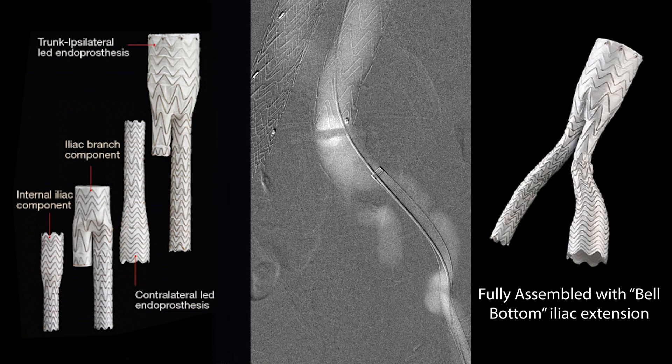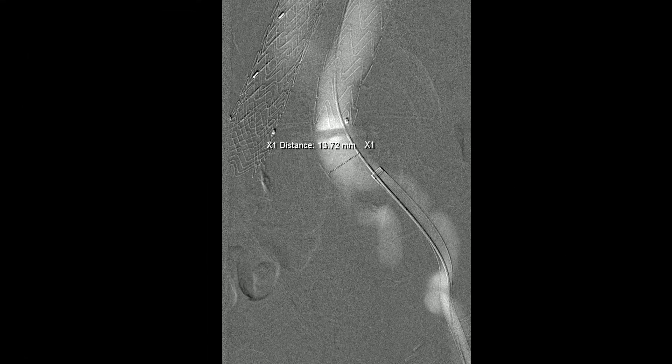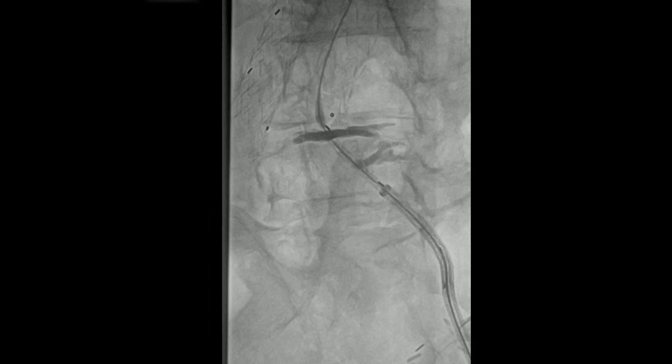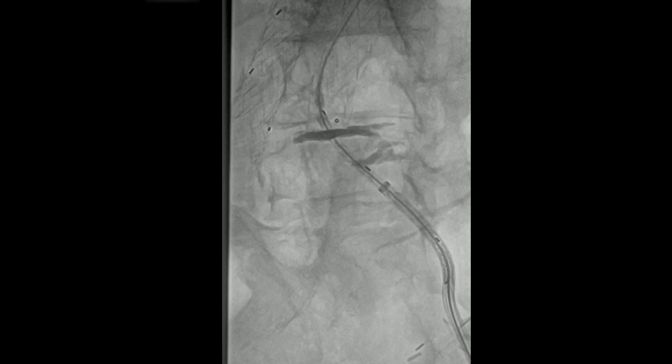Here we're doing it again with CO2. Then we're going to bring the device — most of these devices will go up pretty nicely without having to readvance the sheath. In this case, you'll see — and you always watch for this — it's catching in the bottom end of the iliac limb.